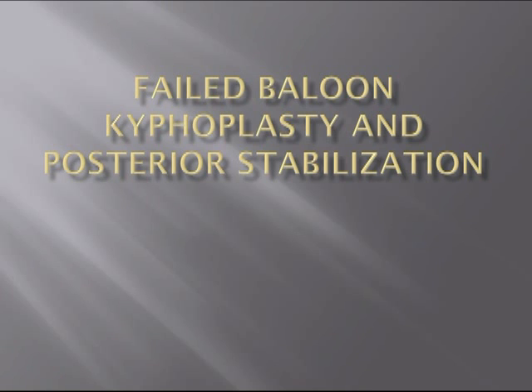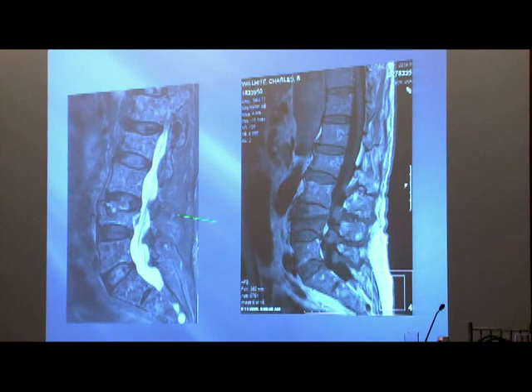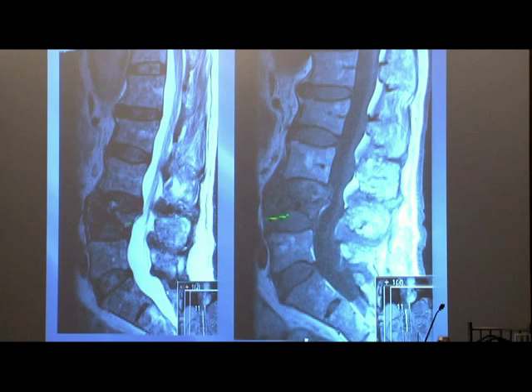This is a patient with an L4 fracture. One of the disadvantages of using the balloon is that if you don't let the cement integrate into the vertebra after the cavity creation, the bone can fracture onto the balloon sometimes, and we see that periodically. Here is a patient who didn't have much cement after the balloons and basically fractured on it.